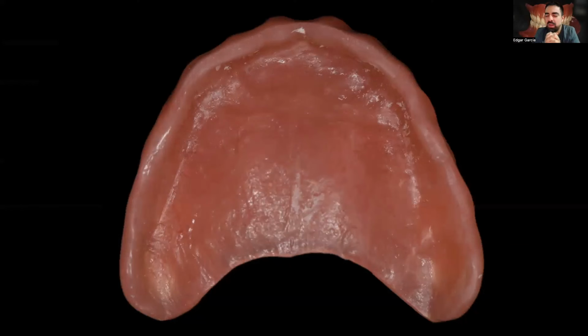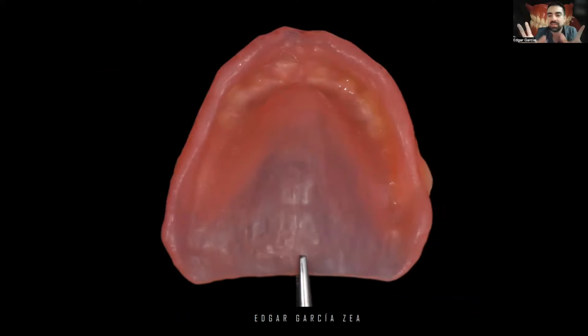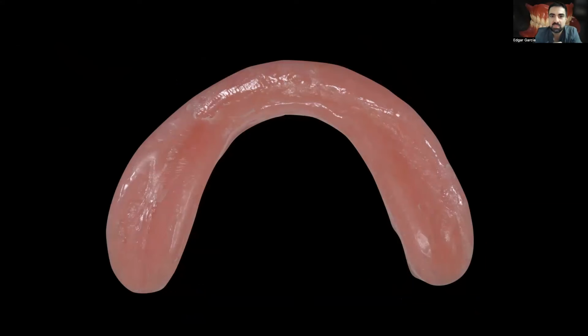Why do I say this? Because this type of denture is the kind that I always receive from my patients in my clinic. As you can see, the extensions are really wrong, so the retention, the stability, and the support have been compromised. Unlike these dentures that you can see, the extension is different. This is our main problem, okay?